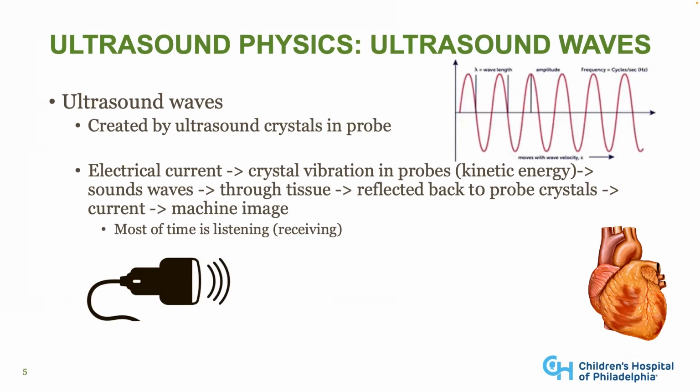The crystals use piezoelectric properties, converting electrical energy into ultrasound waves via vibration of the crystals. The electrical current is converted to vibrations, causing kinetic energy and creating sound waves that go to the tissue. The tissue then reflects them back to the probe and to the machine, which processes them and makes a nice little image for us.